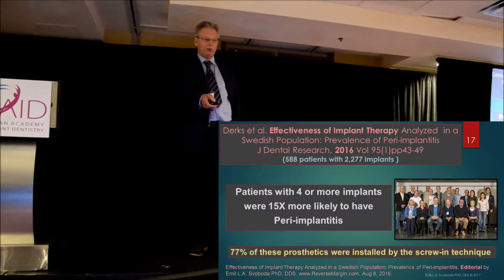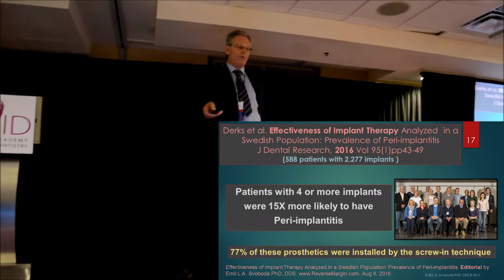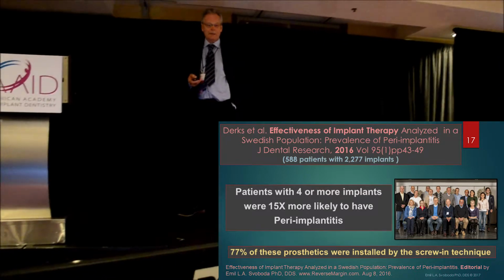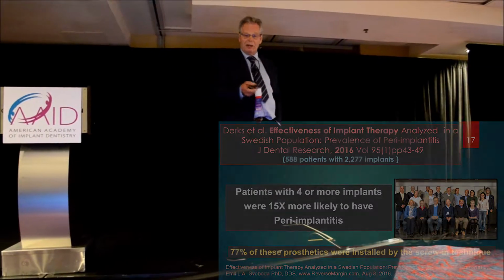And 77% of their sample, and I bet probably most of their more-than-4 sample, because, you know, all-on-4 is over there, 77% of the prostheses were installed by the screw-in technique. Now, the same study came out.